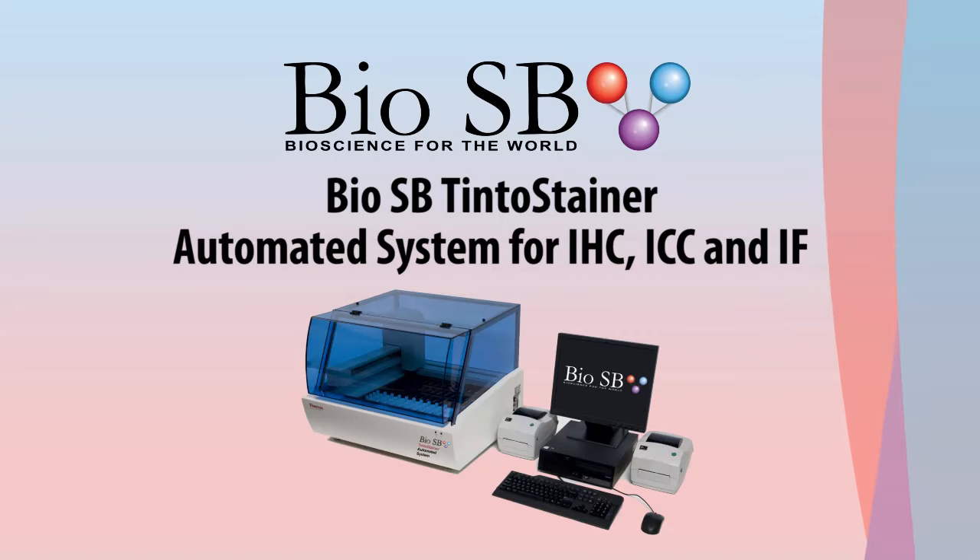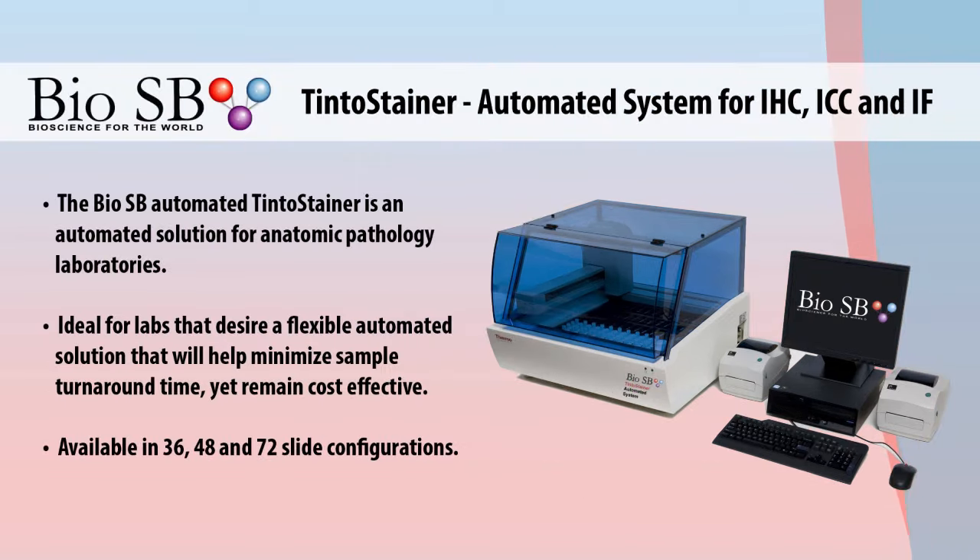The BioSB Tinto Stainer is a rapid, open, and flexible automated system for immunohistochemistry, immunocytochemistry, and immunofluorescence. Ideal for pathology labs that need a flexible automation solution to help minimize sample turnaround time while remaining cost effective.